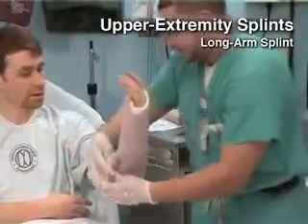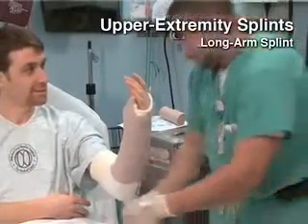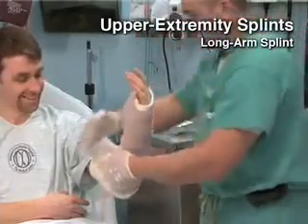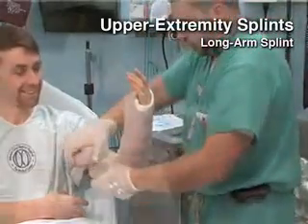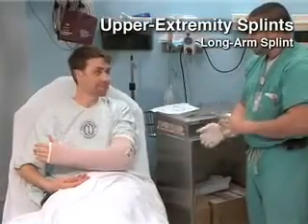This splint prevents flexion and extension of the elbow and limits supination and pronation of the forearm. It extends along the posterior arm from the wrist to the proximal humerus. Place the elbow in 90 degrees of flexion while maintaining a neutral position for the forearm and wrist.